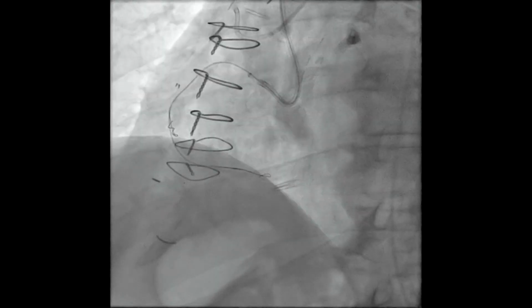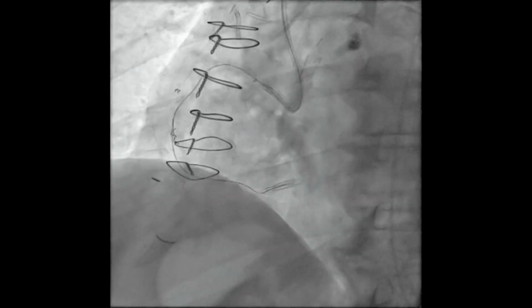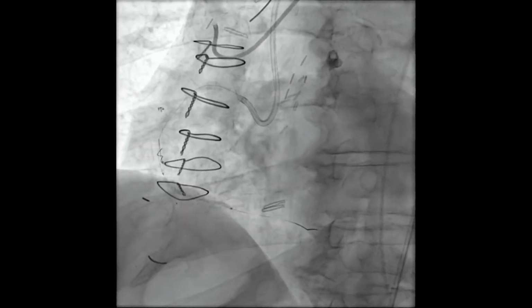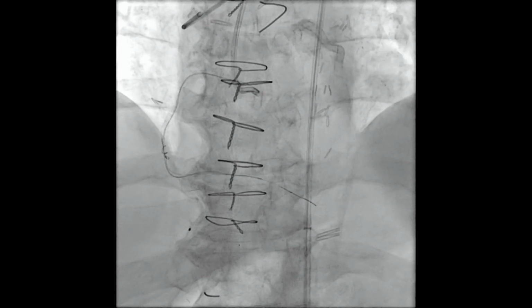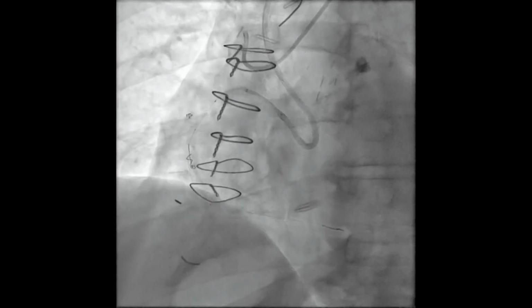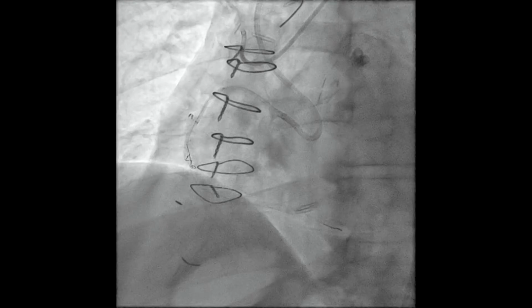and then ended up having to, again, perform subintimal tracking and reentry because of our inability to get things to reenter distally and get the balloons to the distal vessel. So again, we performed balloon angioplasty all the way back. We performed intravascular imaging, which let us 1-to-1 size the balloon to the vessel itself to make sure that we were fully modifying the plaque. We decided to stent the proximal and mid-vessel to improve the outflow.